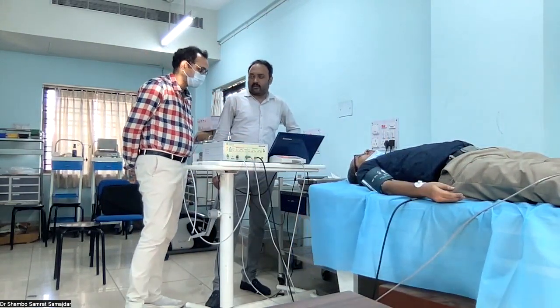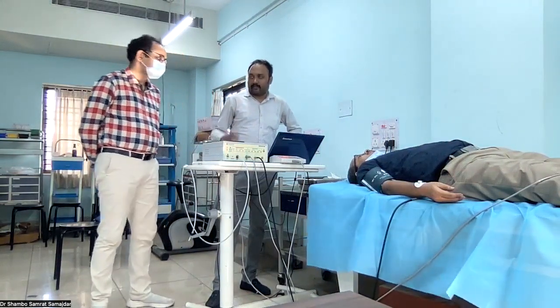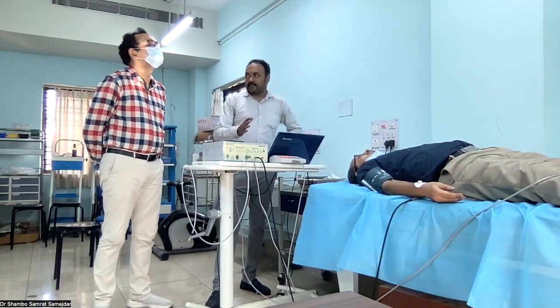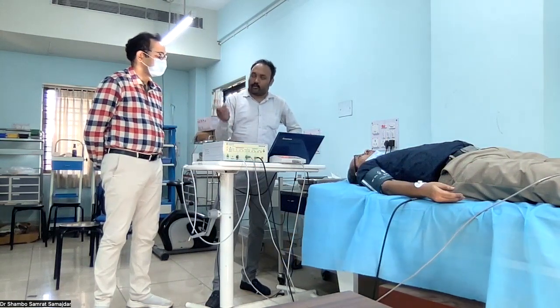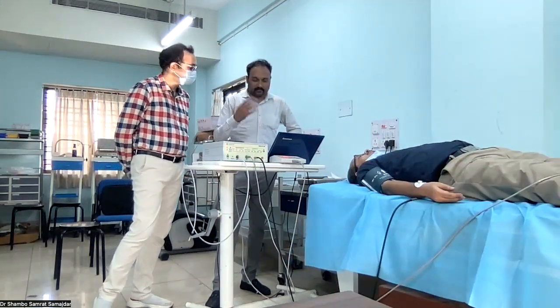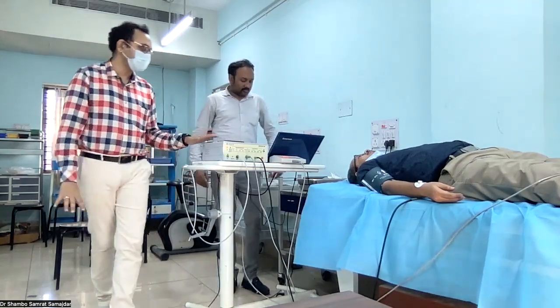At first we will record the blood pressure when the patient is in supine position. After that, we will ask the patient to stand immediately. We will record blood pressure once again. And the patient will remain standing for 1 minute. After 1 minute, the machine will automatically record the blood pressure once again. So we have 3 readings. So here the 3 minute record is not there. So that is one deficiency in this particular machine.